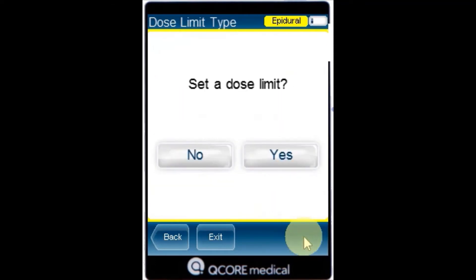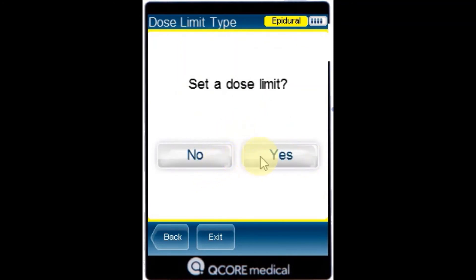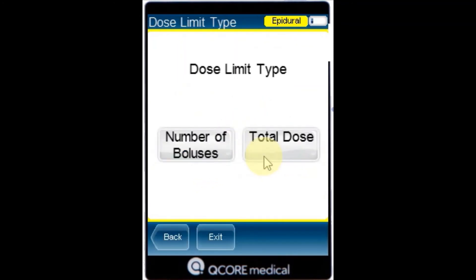From the Dose Limit Type screen, specify whether the infusion is going to be according to dose limits and press Yes to apply, or No to program without dose limits. From the Dose Limit Type screen, select the appropriate Dose Limit Type.